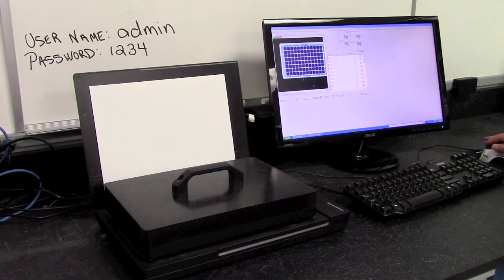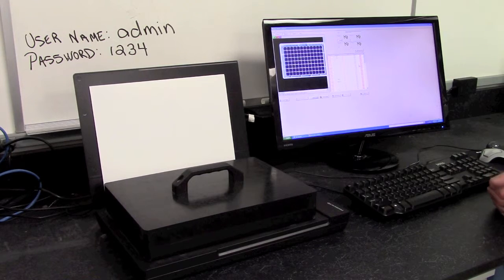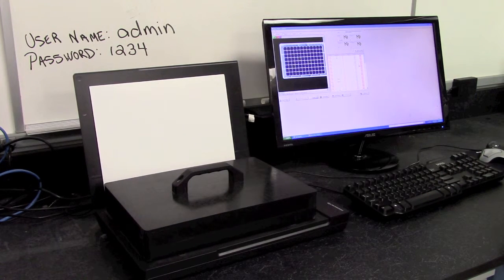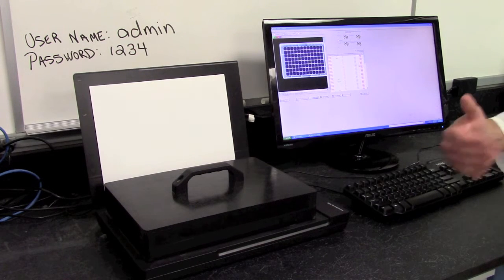So once complete, it will give you an image of the plate, and it will also give you the interpretation. So we're using a numerical score from 1 to 10, 10 being the most positive, 1 being the most negative. So I'll show you in a minute how we set up the thresholds based on this numerical scale to determine what is a passing result, which is a failing result. And that all has been determined here at Charm Sciences.